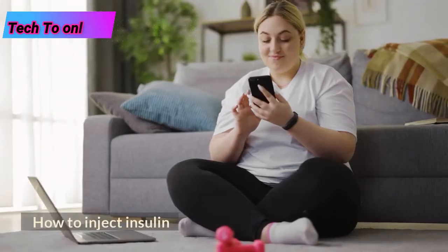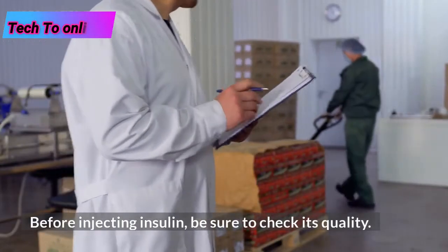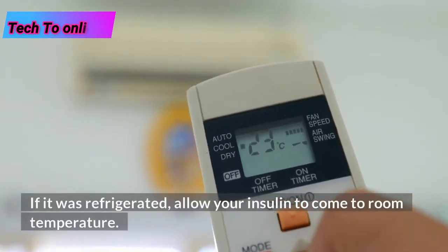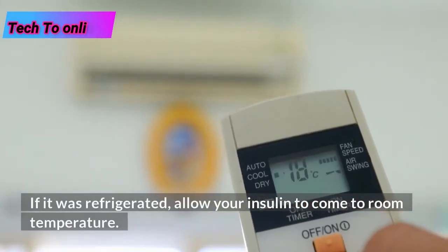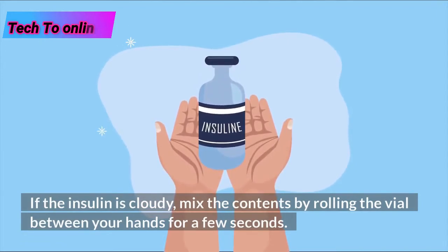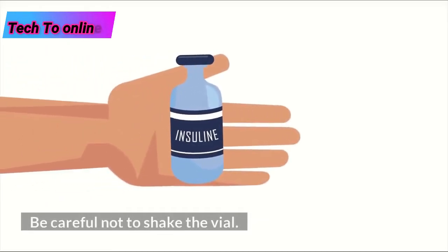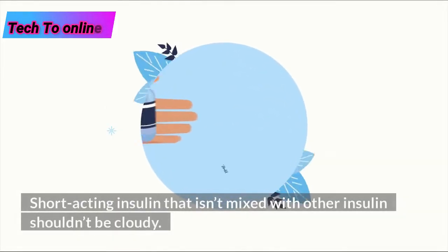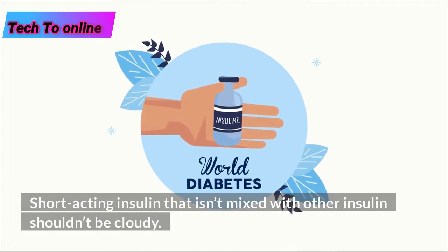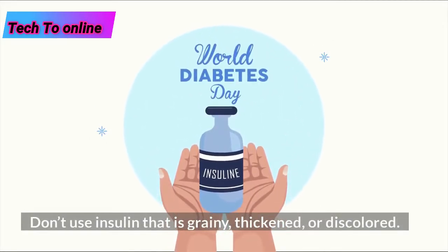How to inject insulin. Before injecting insulin, be sure to check its quality. If it was refrigerated, allow your insulin to come to room temperature. If the insulin is cloudy, mix the contents by rolling the vial between your hands for a few seconds. Be careful not to shake the vial. Short-acting insulin that isn't mixed with other insulin shouldn't be cloudy. Don't use insulin that is grainy, thickened, or discolored.